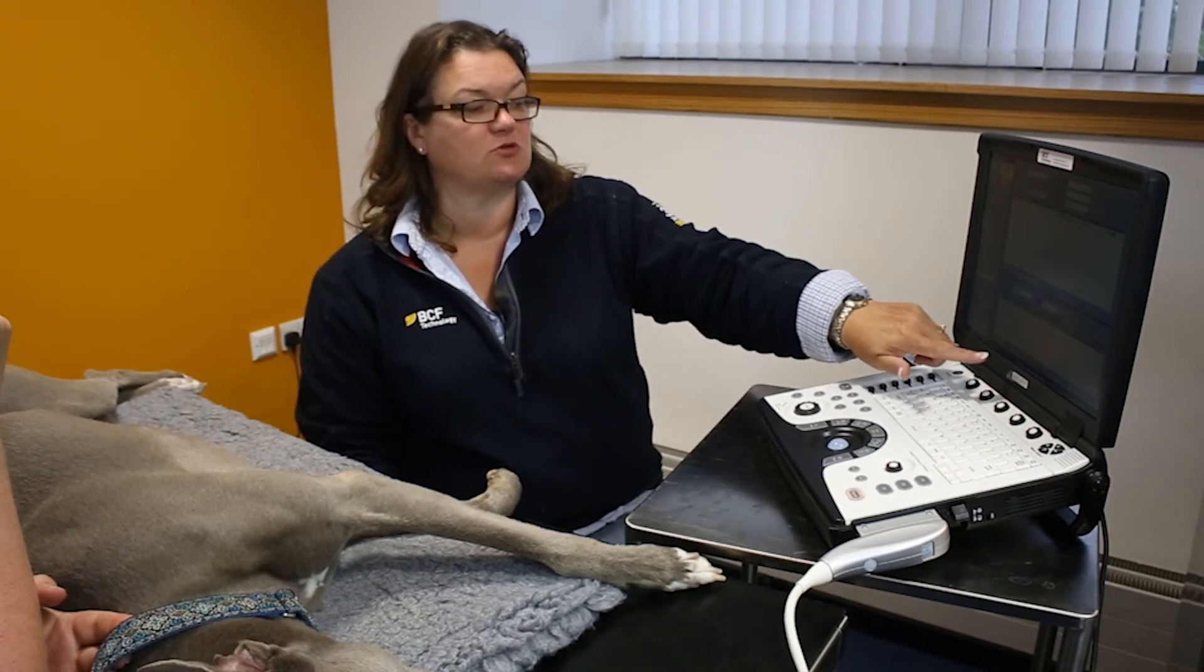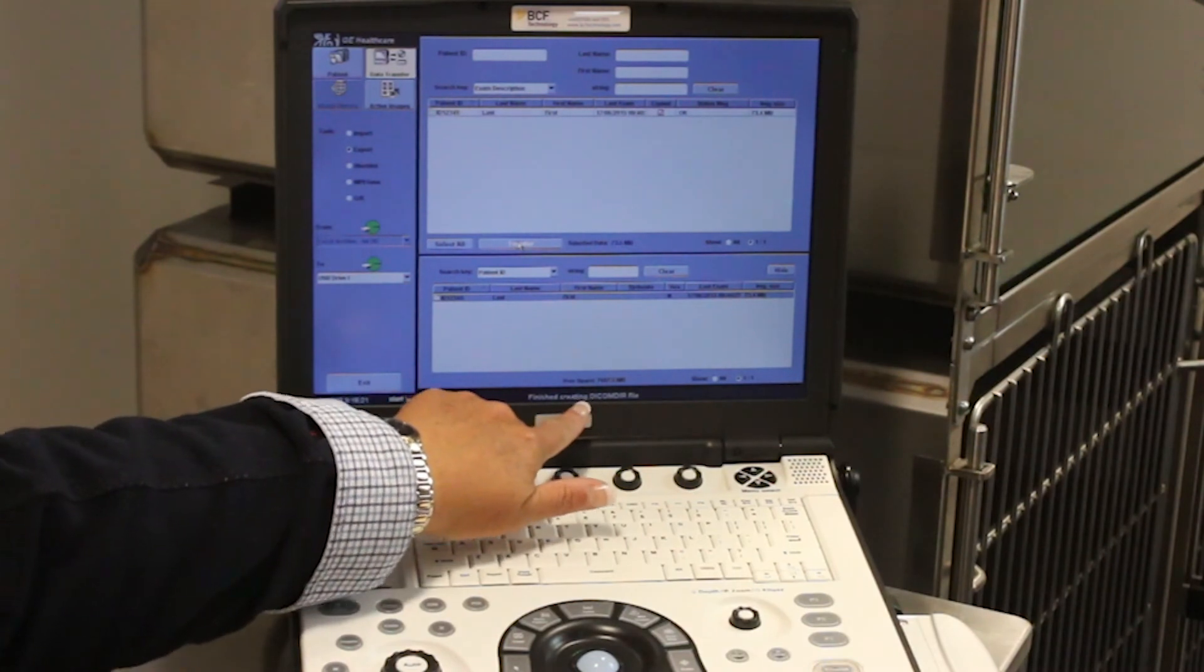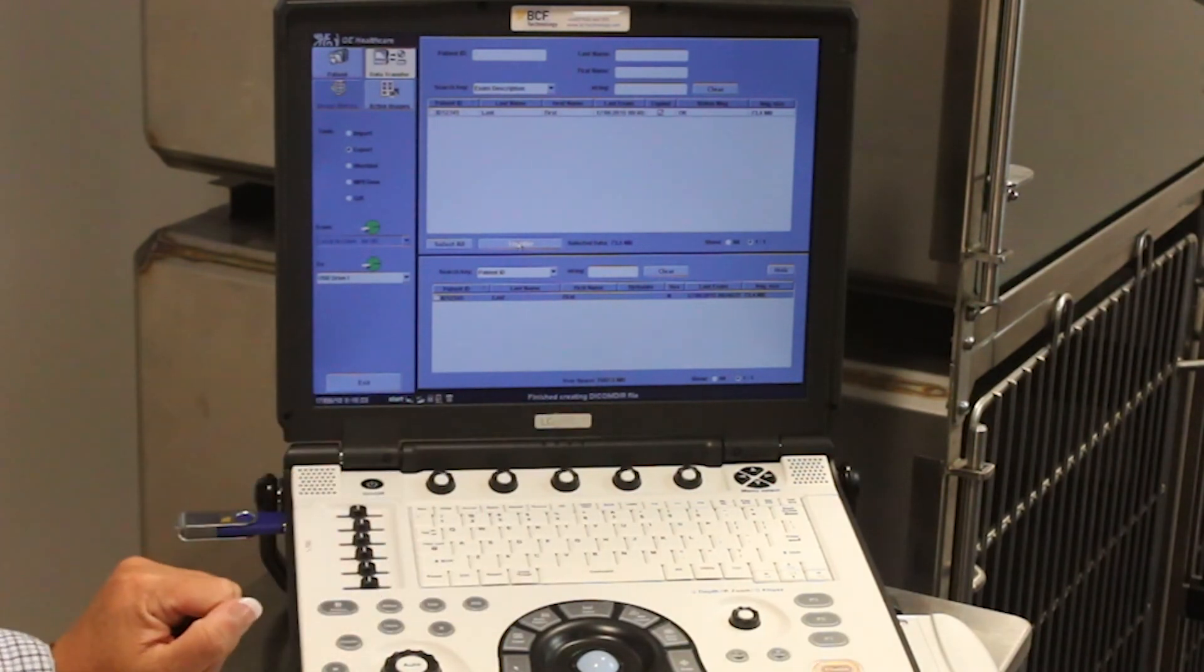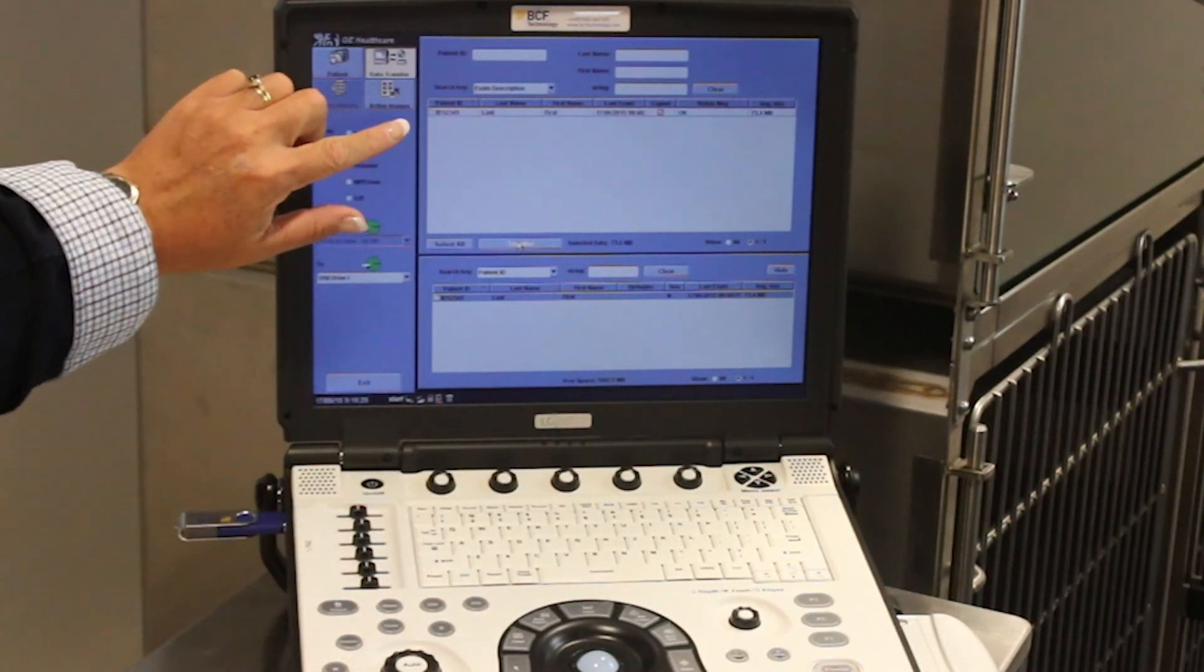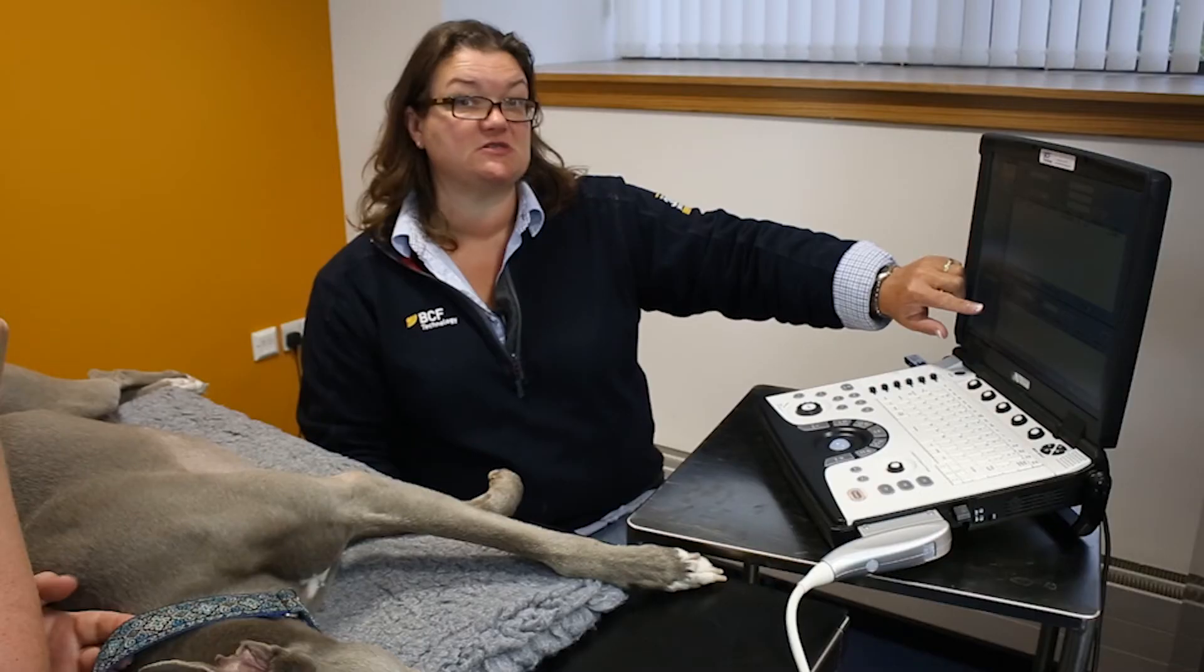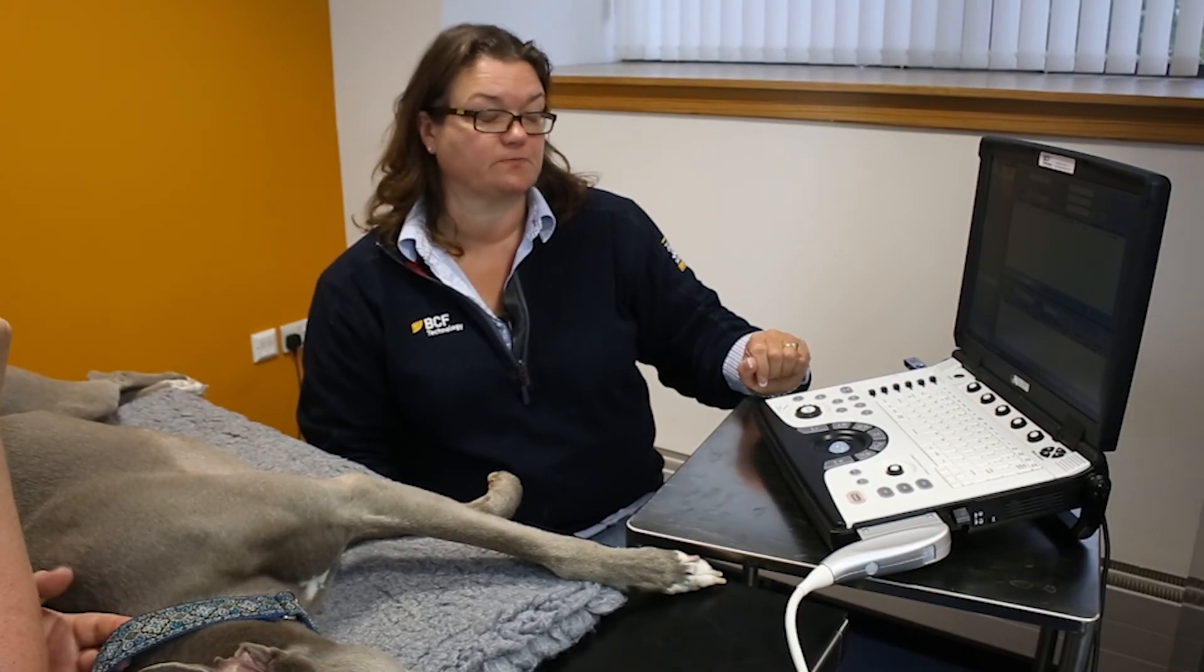You would have seen under here that it's finished creating the DICOM directory file. This means that the information from this patient has been transferred to the USB stick in DICOM format.